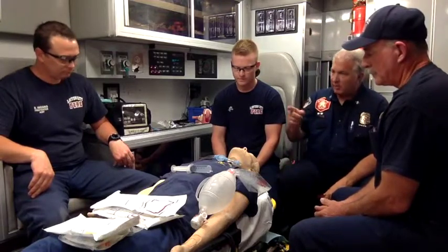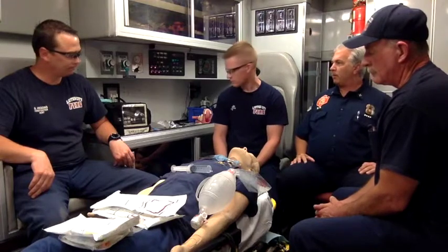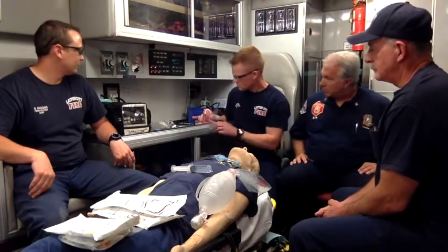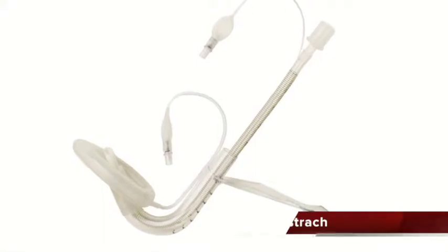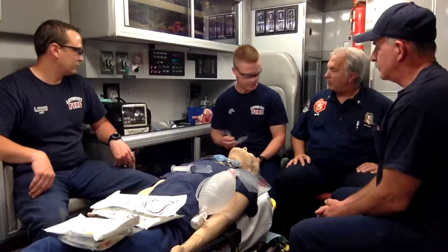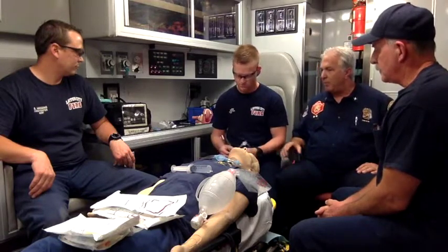So we talked about what kind. Are those the only kind of supraglottic airways we've got? No, they're not. We have the iLMA. Oh yeah, interesting. That's the iLMA. Where do we find that? That's going to be in your emergency airway, in the RSI kit. Let's hold this thought for a minute.